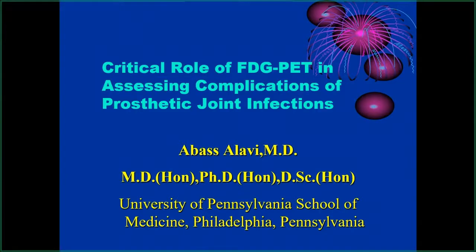I'm going to discuss with you some work that we and others have done in assessing the role of FDG-PET imaging in complications of prosthetic joint infection.